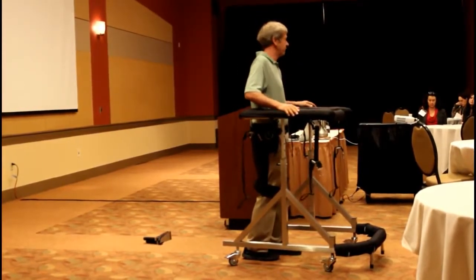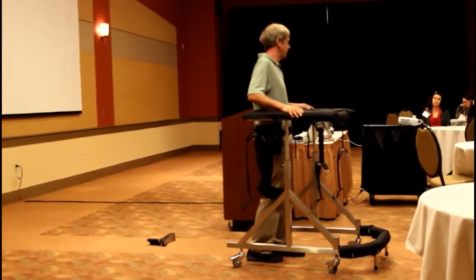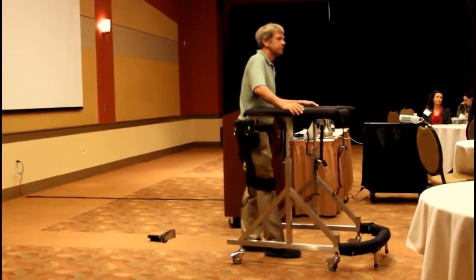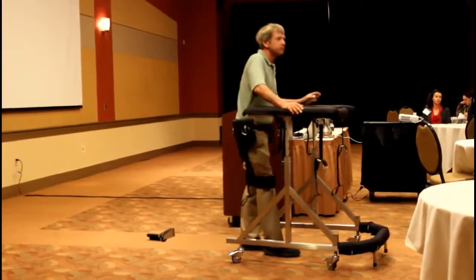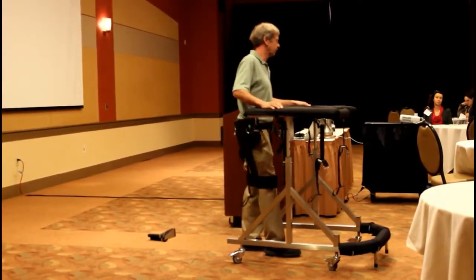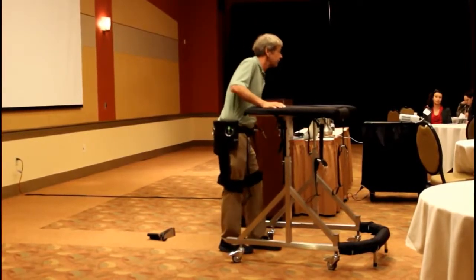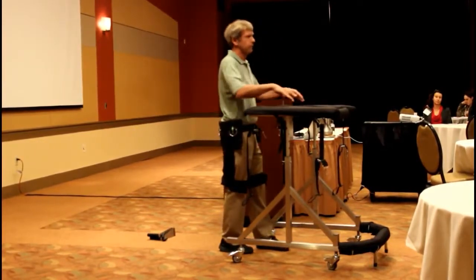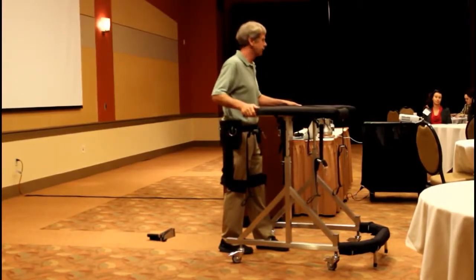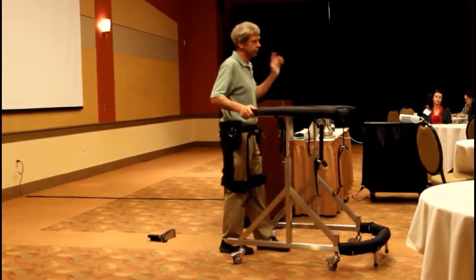And we've had quads in here that are C5s. Yeah, I was just going to say, I think I've actually seen a quadriplegic patient on one of those. Yep, and there's two or three that we have from the Detroit Medical Center that are actually using e-stim in these, and they're actually going right down the track. And these are people that hadn't been vertical.